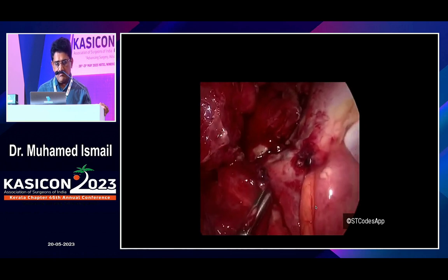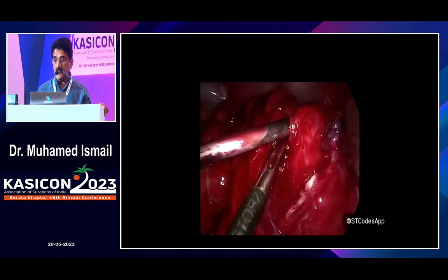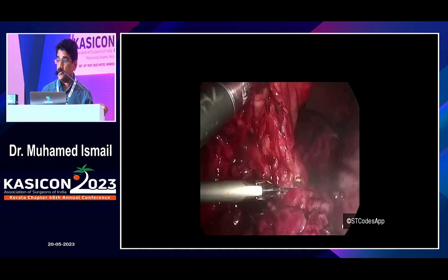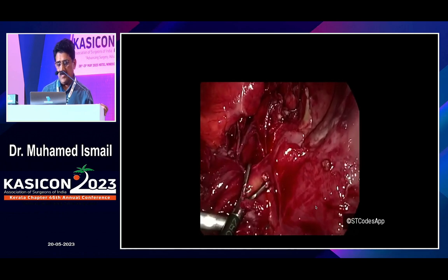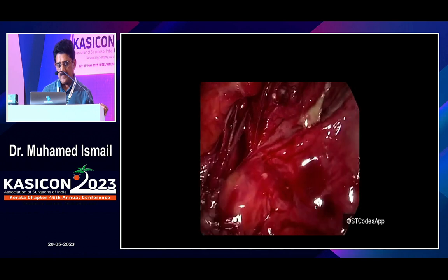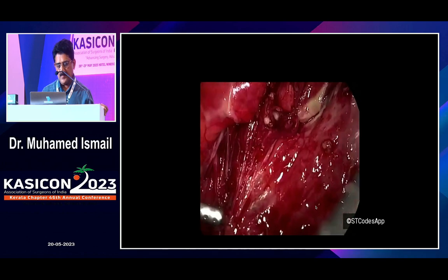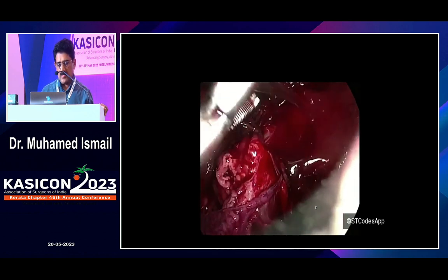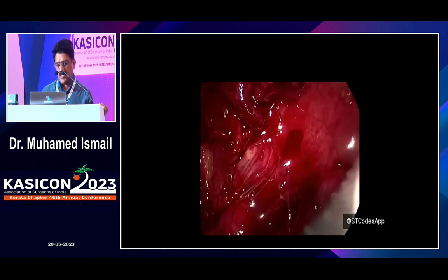We still could not identify the tubular structures or the tip of the appendix. You have to be very careful in these situations because the whole area is inflamed and there may be injury to the cecum. The adhesions were released, and what appears to be the tubular structure I was looking for was slowly released with hydrodissection. That is the appendix going down — slowly the tubular structure is coming into picture.